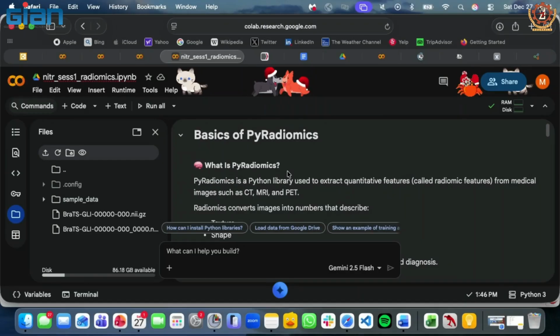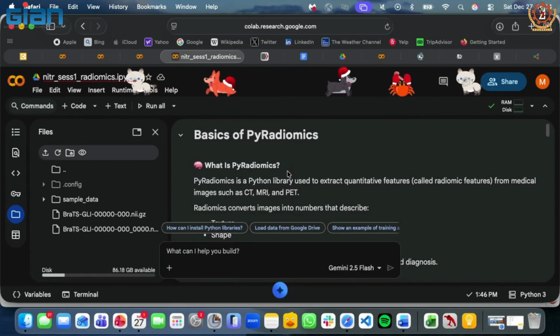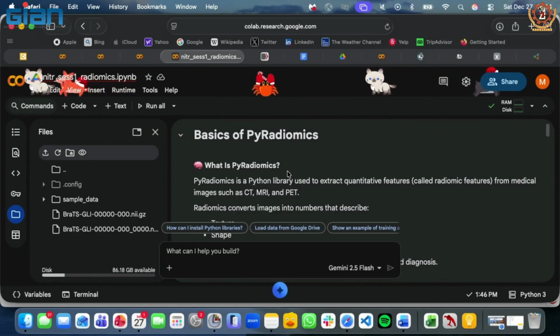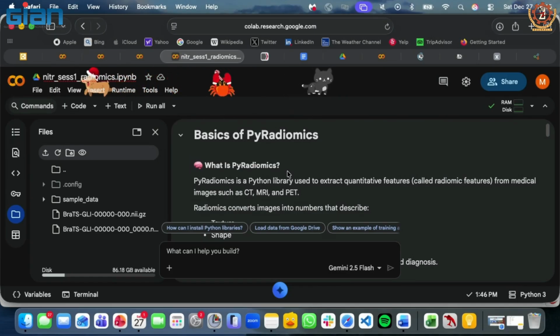Okay, and so radiomics had been very popular. Actually, Dr. Prasanna did a lot of work in radiomics. Basically, he was one of the starting persons who did radiomics. And when radiomics got famous, a group at Harvard, AIM, AI in Medicine, made a Python library public called PyRadiomics. So if you have the radiology images and the tumor segmentation masks, you can very easily extract these PyRadiomics features.